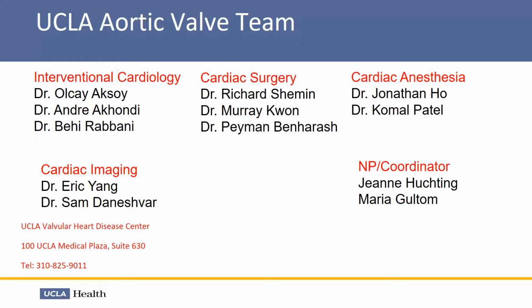And I think we do want to bring in the Medtronic valve, but we would probably use it only for patients with very small annuli and also valve-in-valve procedures where they have a small valve to begin with. I think that would be a niche indication. But outside of that, as a first valve for a younger patient, I think Sapien 3 is better for coronary access, and gradients are relatively similar anyway. If you have a big enough valve effective orifice area, you can put a big valve in, and Sapien 3 is fine.